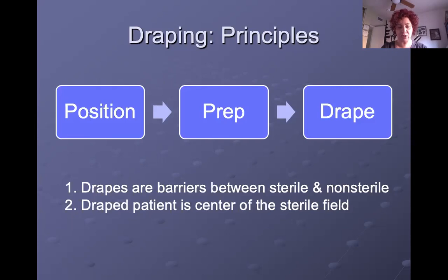Sometimes if the surgeon has someone that's helping him or her, then we'll be passing the drapes, just handing them over in order of the way that they're going to be placed, and the surgeon and the assistant will do the draping. If it's just someone like the surgeon, sometimes the assistant will come in early or the PA will come in early. But if it's just that one individual like the surgeon or the assistant and you, then the two of you will be doing the draping.